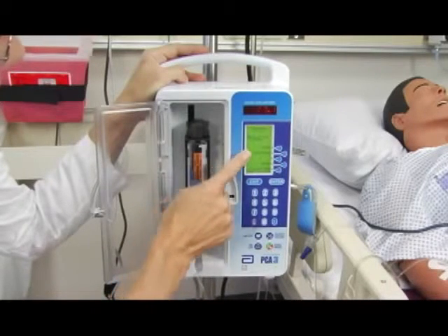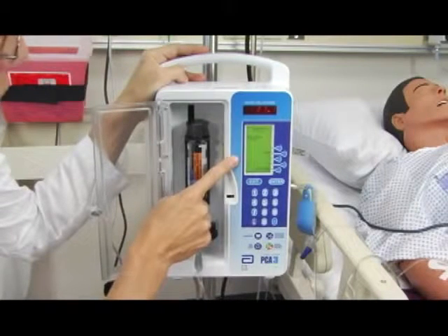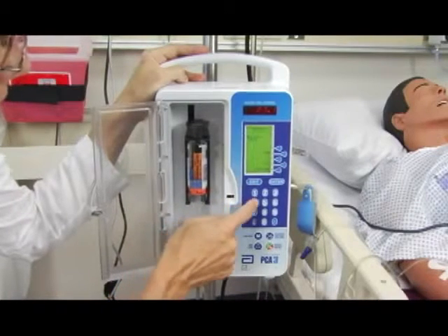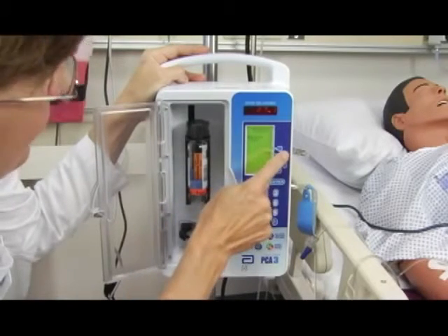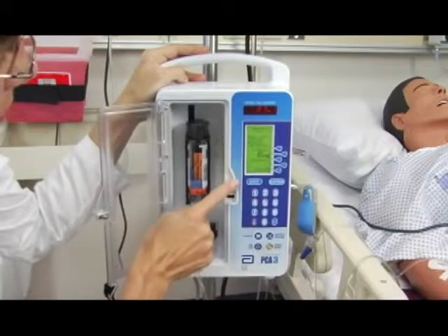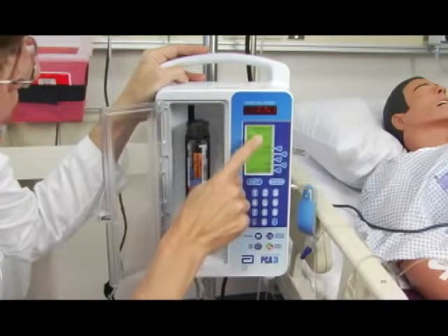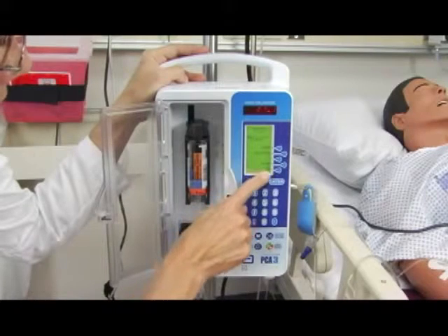And then we have the dose limit. If the physician orders a dose limit, you can enter it here. Let's say the physician ordered a 4-hour limit of 45 milligrams. First, you would hit the soft key that says yes. Then it would allow you to choose the amount that you want. There's 45. We'll hit enter. Now that we've reset everything that the physician has ordered, we want to save and exit.